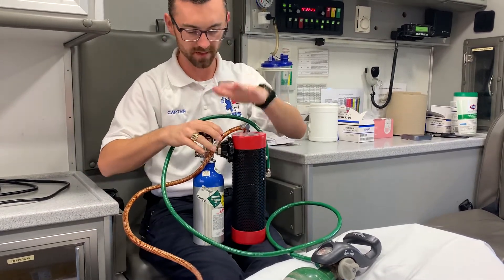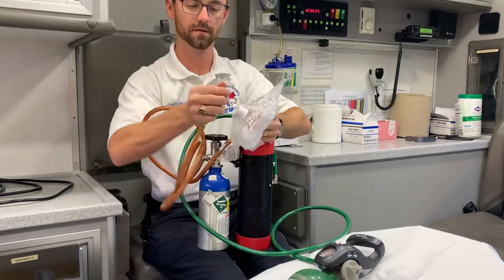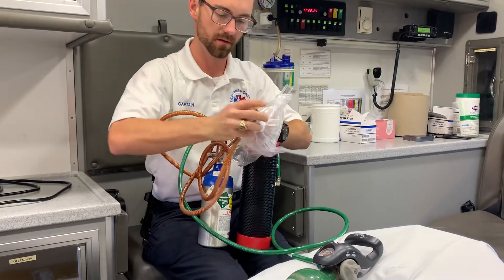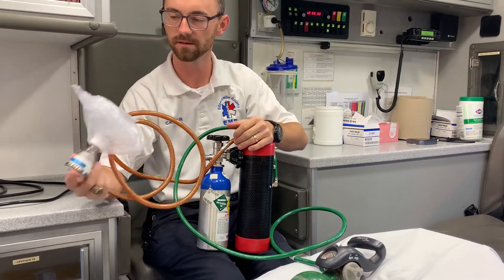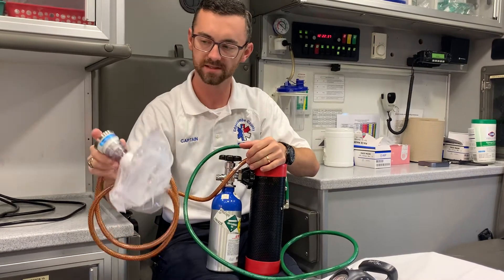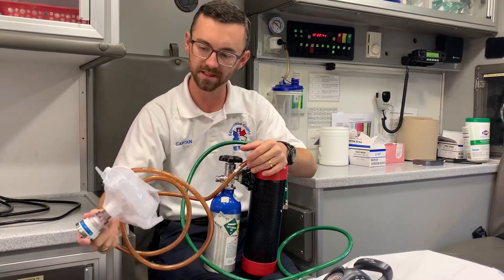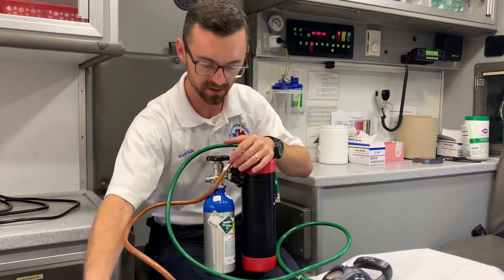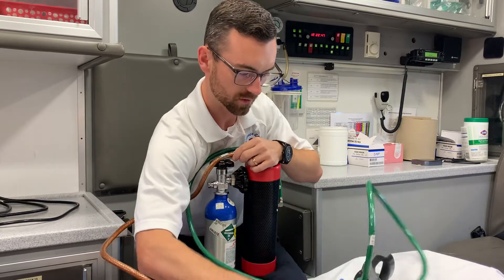For this system to work, it has to be upright. We will then put the demand valve on the mask. The mask then goes on the patient, and as they breathe, the medicine will flow through the tubes. That's pretty much it to the system.